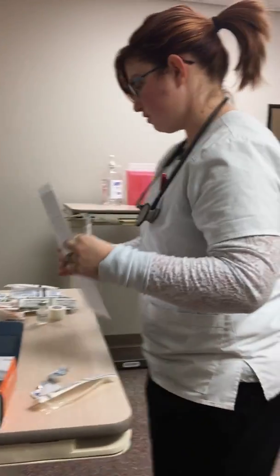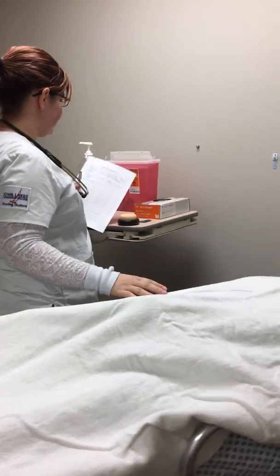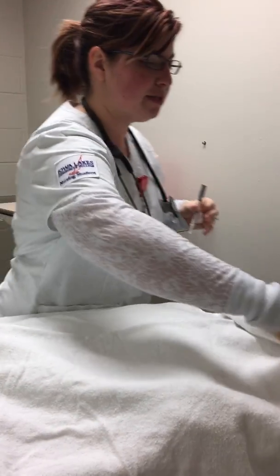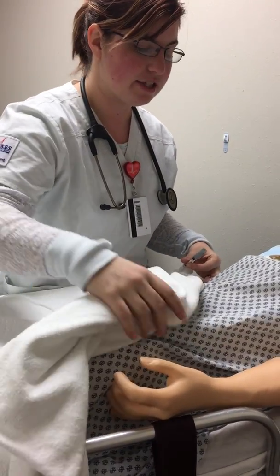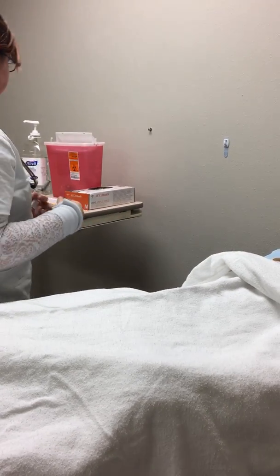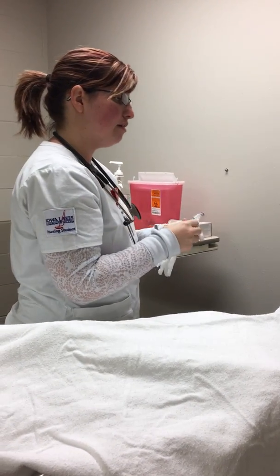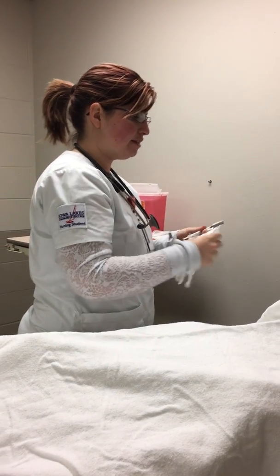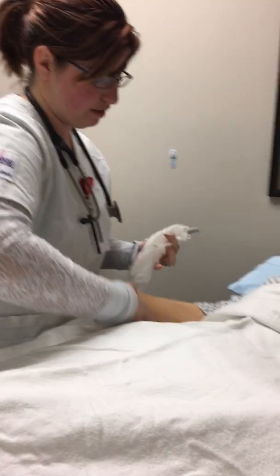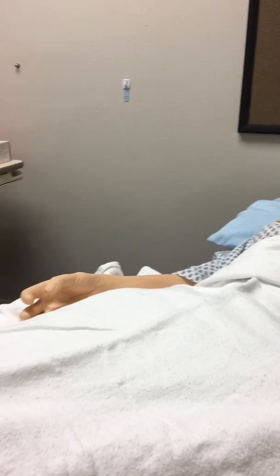Alright, let's go back and see our patient, Mr. Brown here. Hi, Mr. Brown. It's Robin again. I have the TB test for you. Can you verify your name and date of birth for me? Perfect. Allergies? Perfect. I know that can just get tedious sometimes having to say that. You'll say it in your sleep eventually, won't you? Have you chosen what arm you would like your TB test to go? The right? Perfect. So we're just going to pull up his right arm, and there's no lacerations, tissue scarring, or tattoos, so that's a perfect choice.